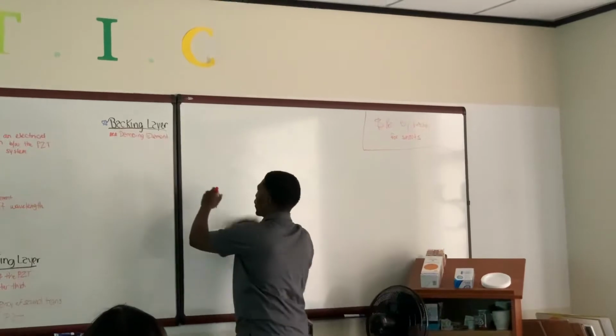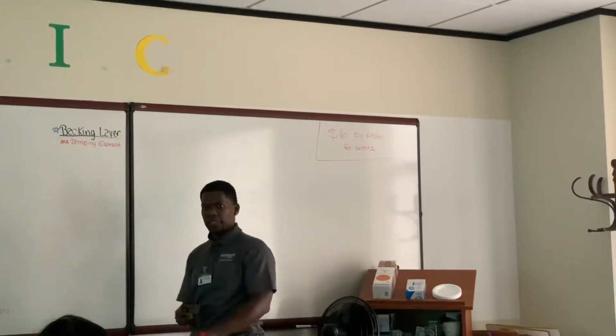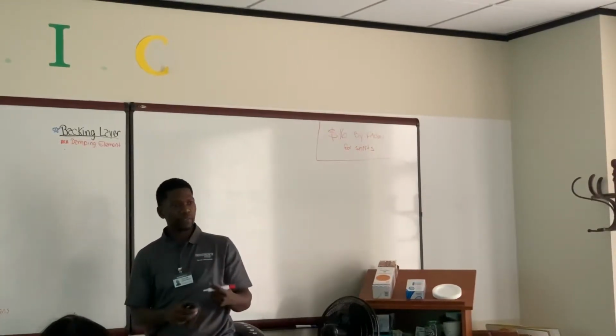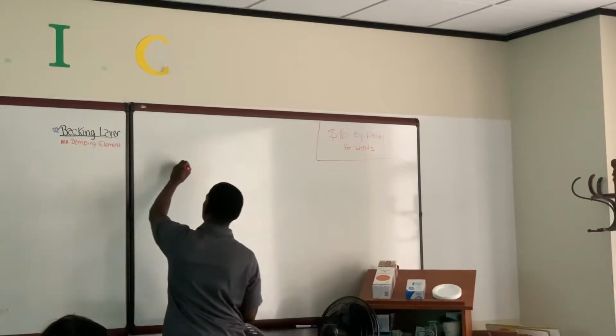Depending on our transducer, depending on how thick the backing layer is going to be, it's going to be thicker the faster we need it to stop. Okay, because that's what the backing layer does. It stops the PZT from ringing, so we can listen for reception.